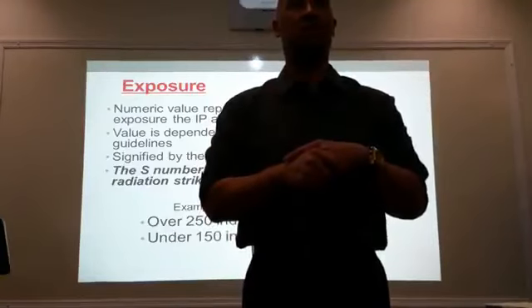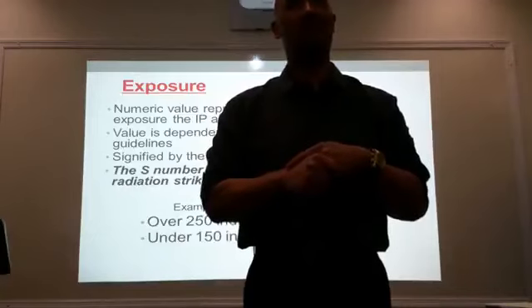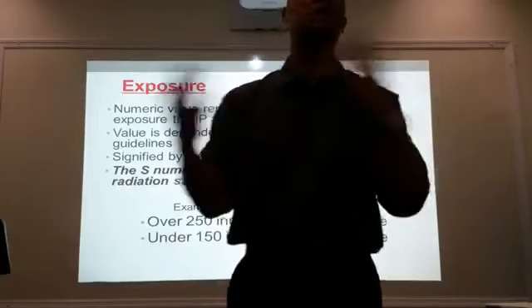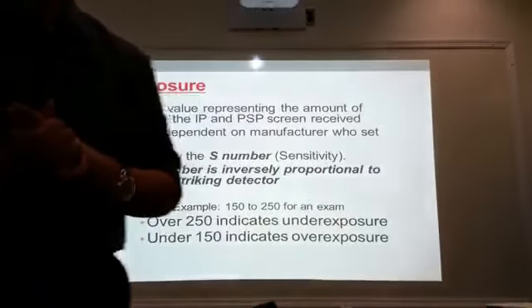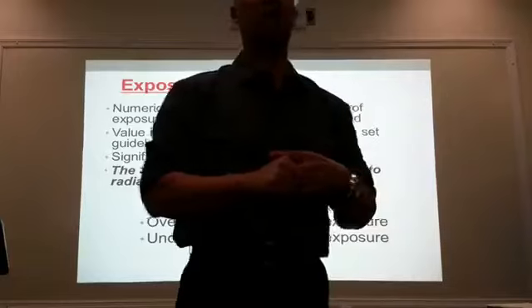So it's kind of like we give it a base and they kind of edit it for us? Exactly, exactly. Okay, so again, regardless of what technical factors you use, the algorithm is going to fix it for you so that your image comes out well all the time.